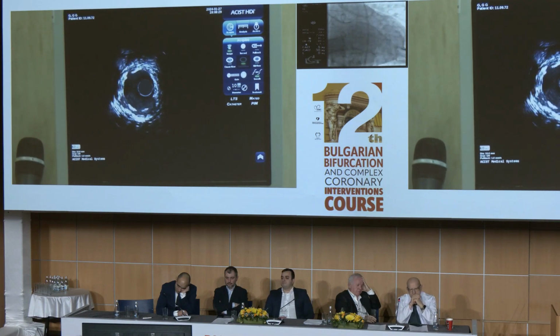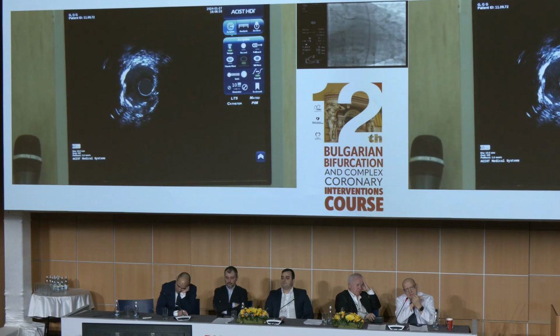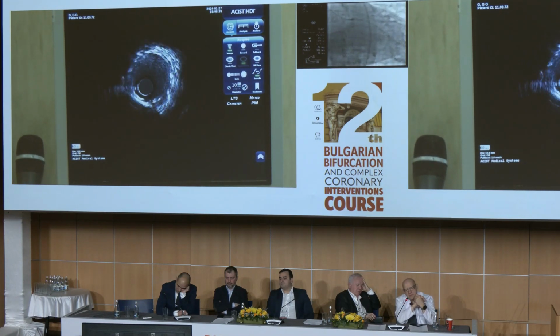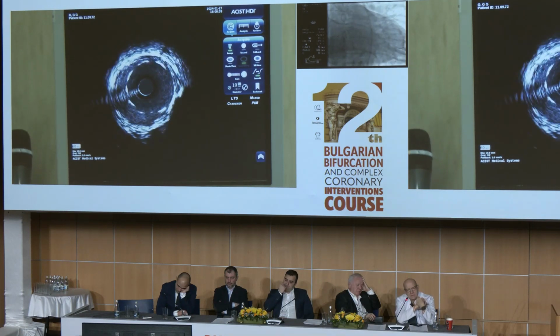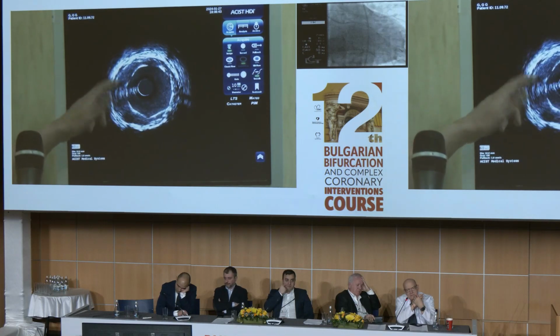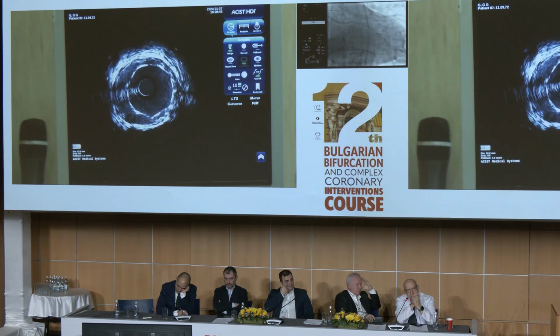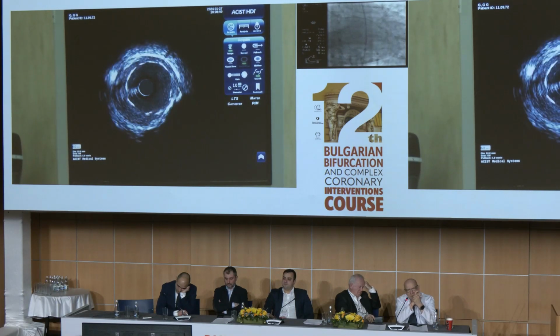And this malposition is only, let's say, in not a big circumference. So here it is more pronounced. Yes, this is in the aneurysm, but you cannot correct this, in my view. Or it will even be more dangerous for the rest of the vessel.